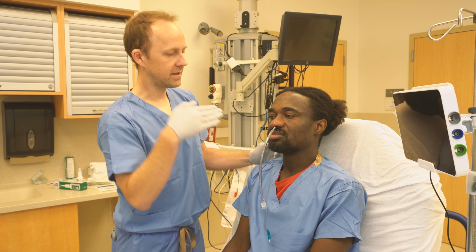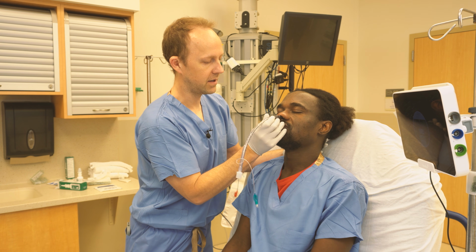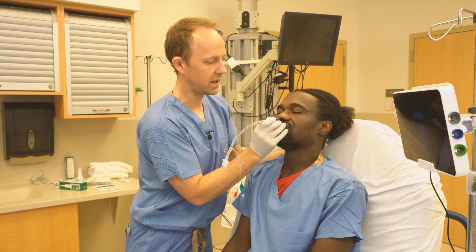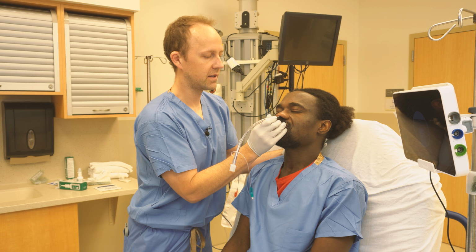Okay, so you advance this obviously directly perpendicular to the face along the floor of the nose. Slowly, and coaching your patient here is critical.